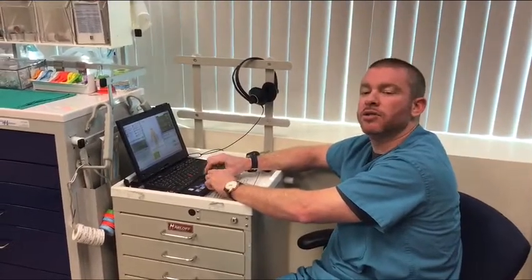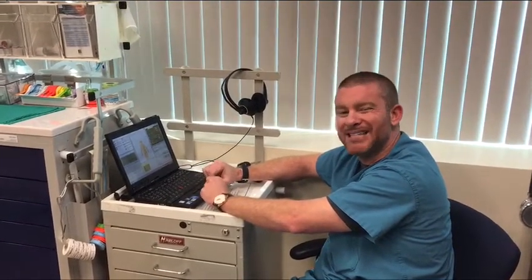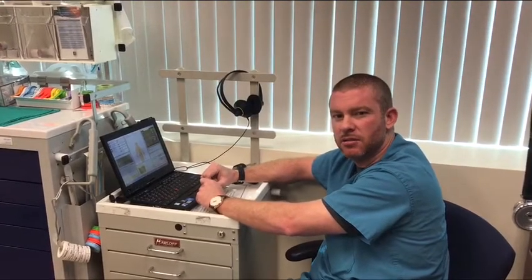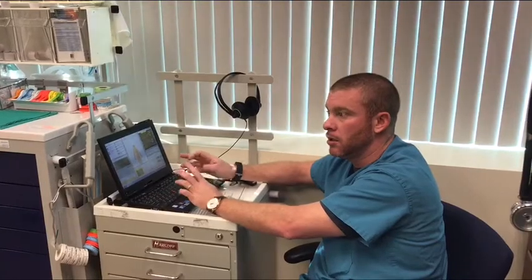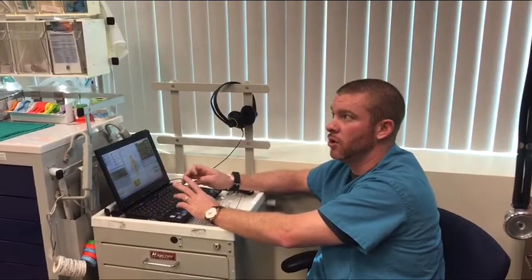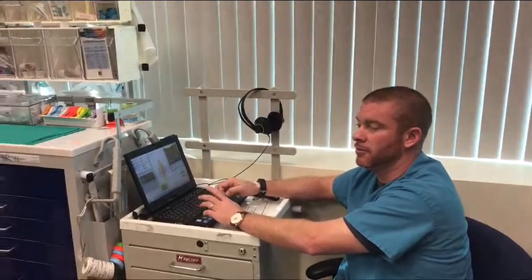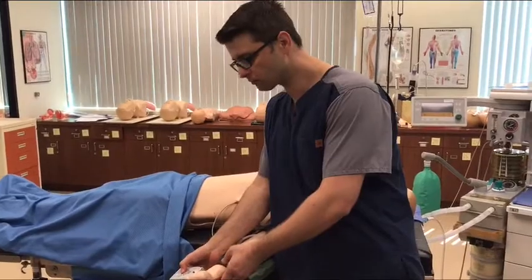What's another thing we're going to be doing? We're going to be looking for spontaneous ventilation. What's another thing we want to assess? That his train of 4 has gotten better. Do you want to wait until he opens his eyes to do that? No, I do not. So I'm going to check that train of 4. 4 out of 4.